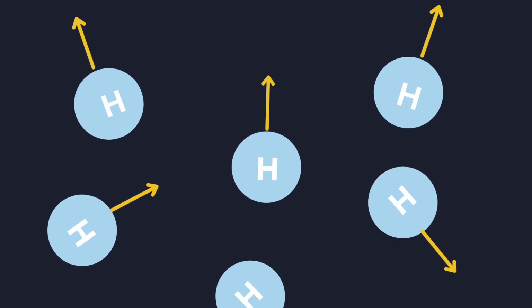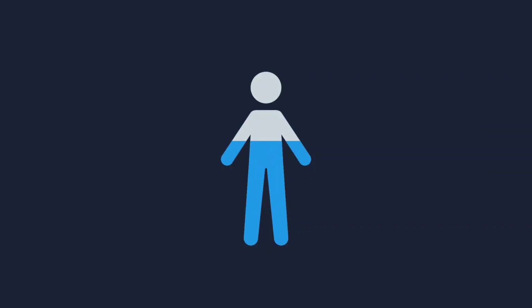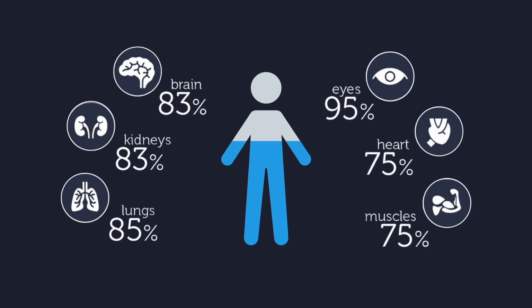So, what information do these radio frequency signals give to us? Since different parts of the body have different water content levels and unique compositions, in each tissue, the protons relax at different rates and produce distinct signals. Abnormalities and disease can increase water content and may be detected through unusual signals corresponding to heightened water concentrations. This is how MRI scans differentiate between different tissues.